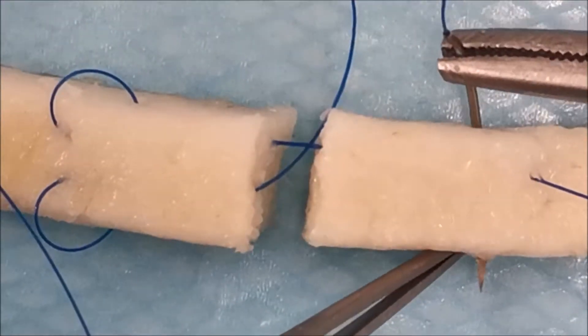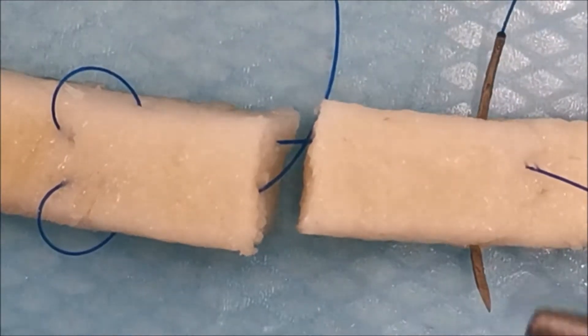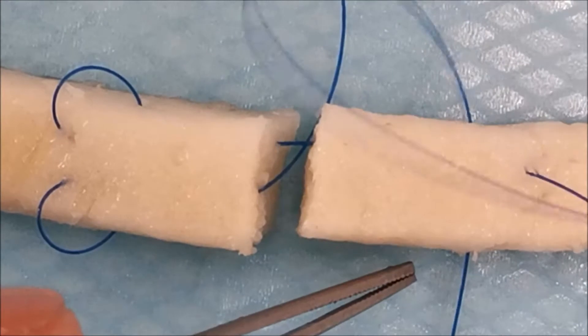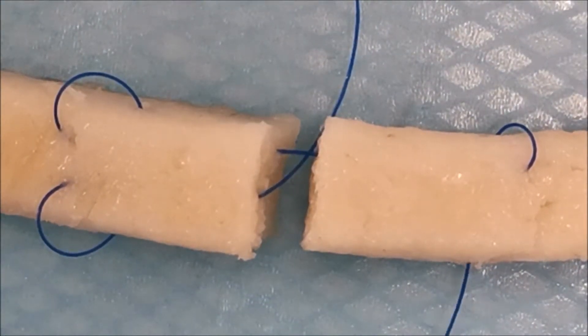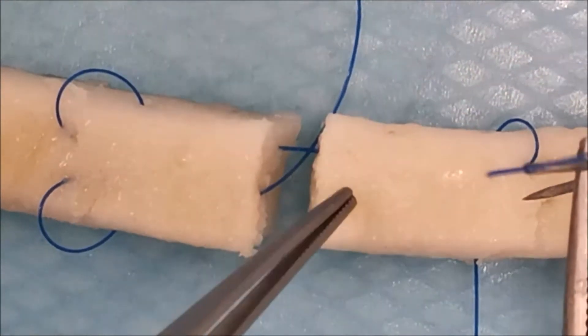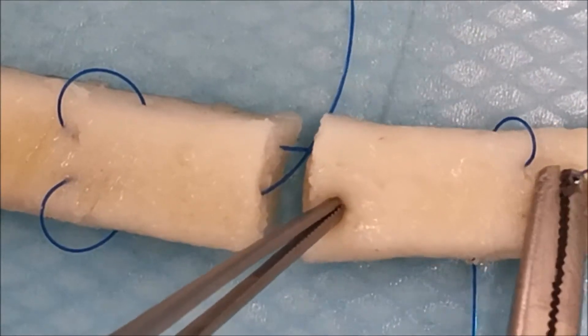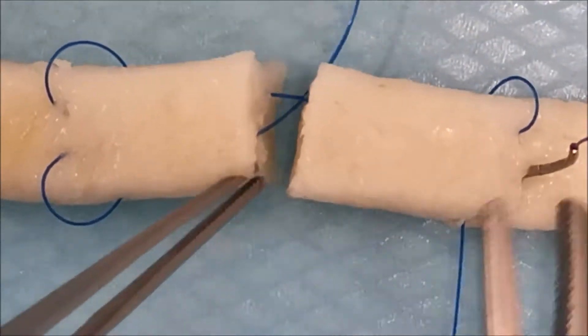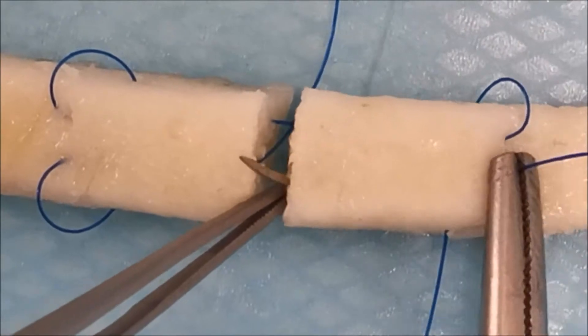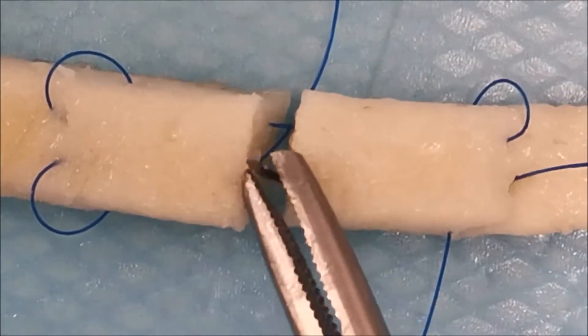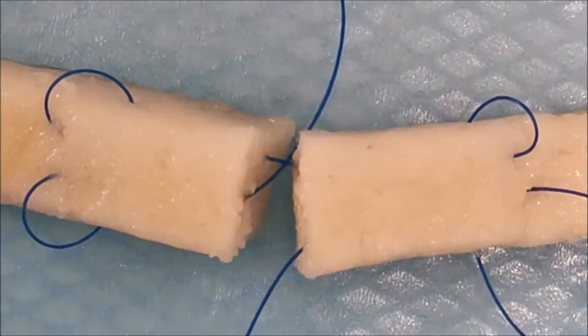It's important to take the transverse bite closer to the repair site as opposed to the longitudinal bite which is away. This is important in order to create a grasping loop as opposed to a loop which does not grasp.